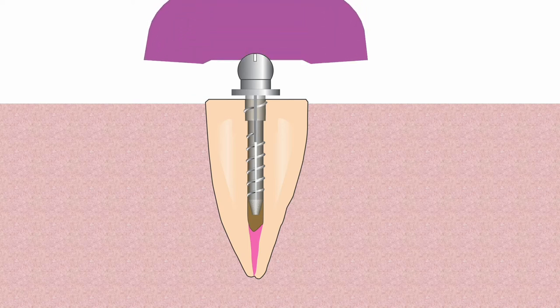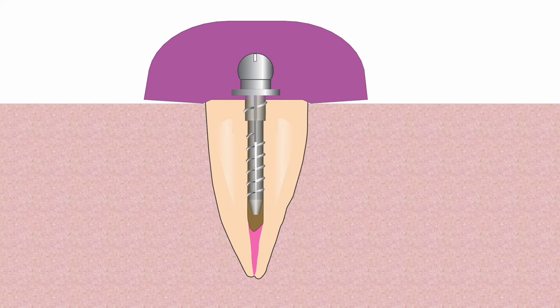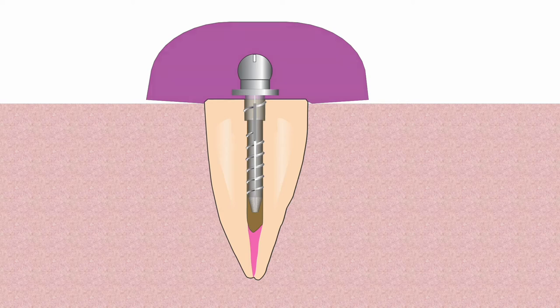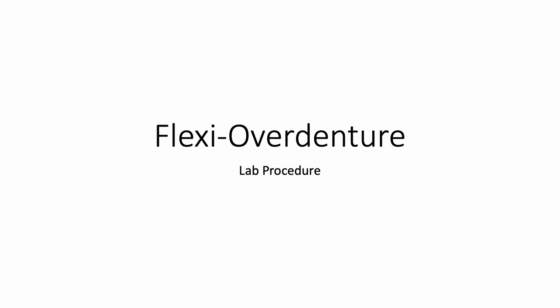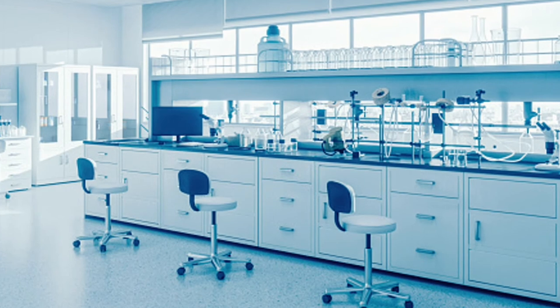After achieving proper post seating, take an impression of the trial seated post. It is important to note that the post is not cemented in place at this point. Remove the impression from the post, remove the post from the canal, and temporarily seal the canal. Send the impression to the laboratory along with the brass transfer stud, which you may or may not have inserted into the impression. The laboratory places the transfer stud in the impression and pours it up in stone or plaster, then waxes up and casts the coping.